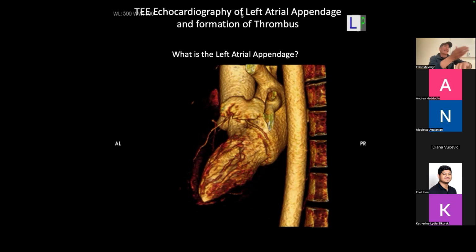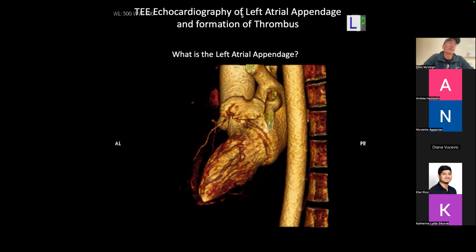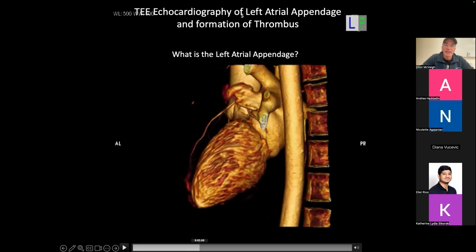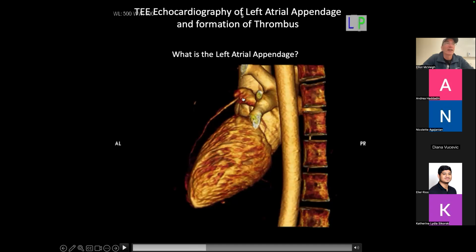You don't want to keep bleeding, right? You need to start it clotting, right? So here is the left atrial appendage. You can measure whether or not there's a clot in there in CT like nobody's business, right? You can see very tiny clots. And then when it contracts, boom, see that? See how small it gets when it contracts?